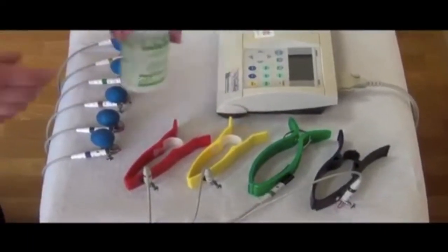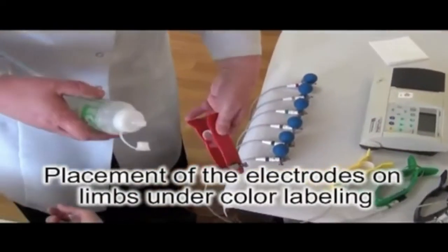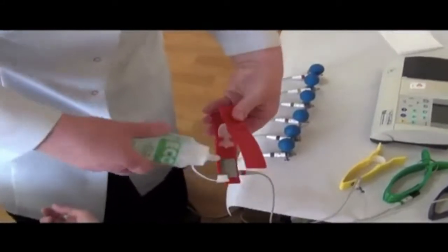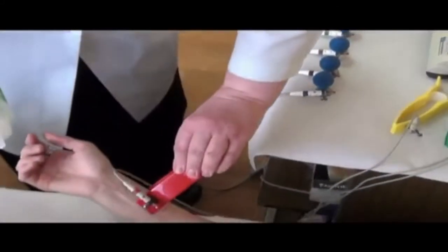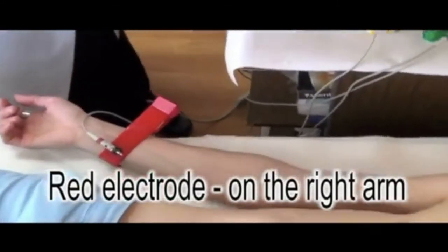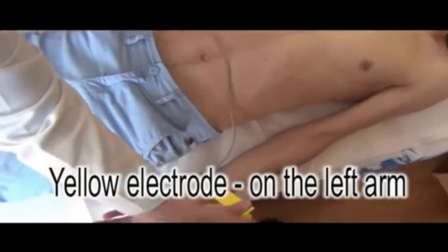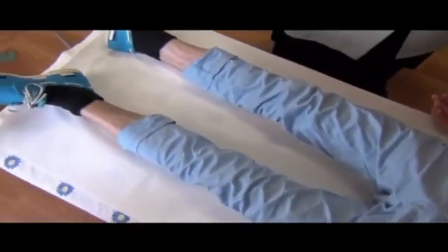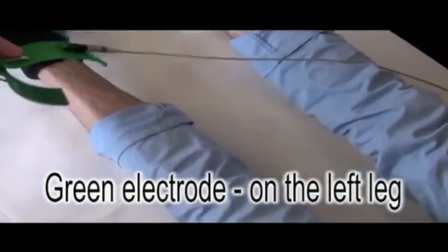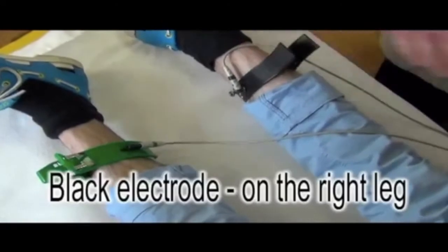Red electrode on the right arm, yellow electrode to the left arm, green electrode to the left leg, black electrode on the right leg.